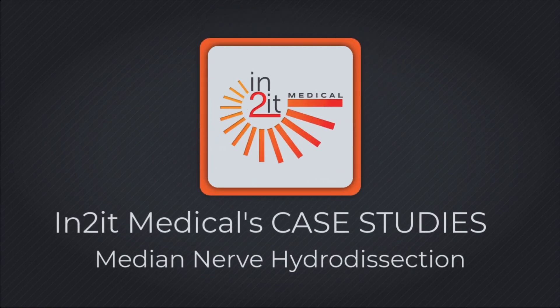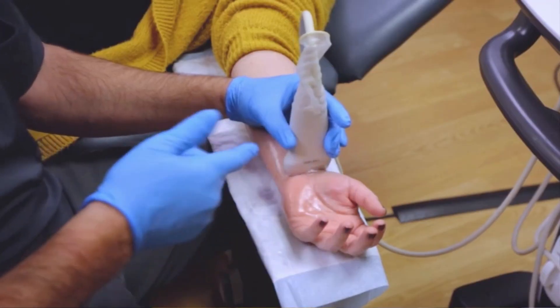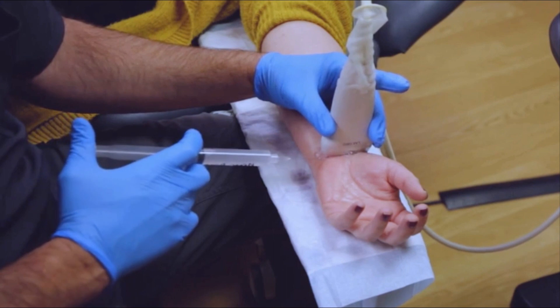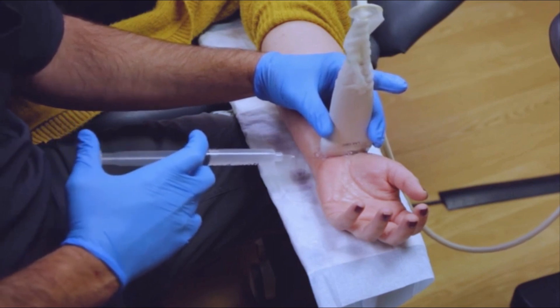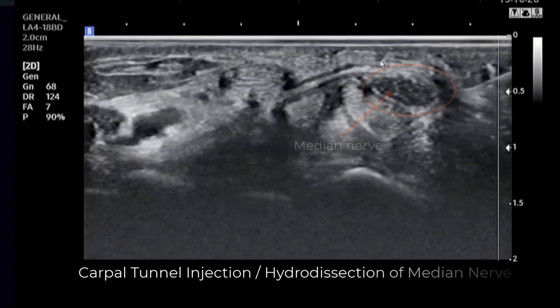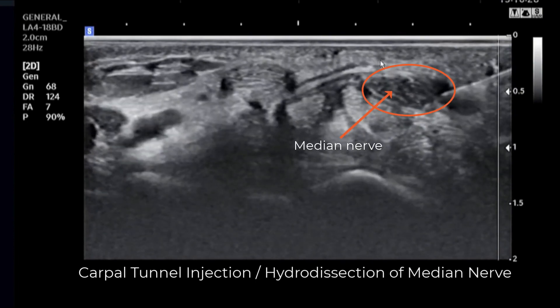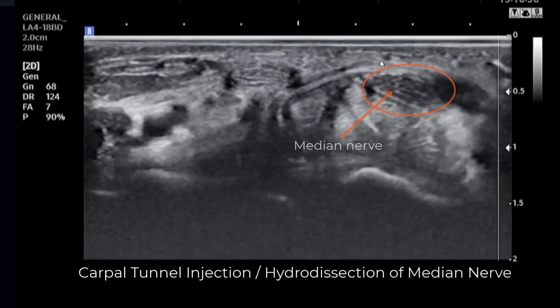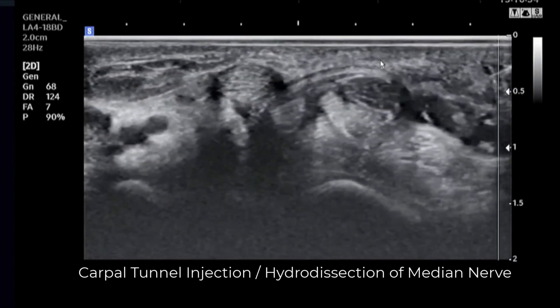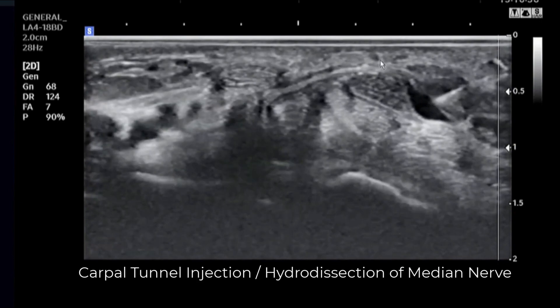Welcome to Intuit Medical's case studies. Today we are discussing the advantages of using ultrasound to perform a median nerve hydrodissection. A hydrodissection is when water, or in our case D5W or dextrose in water, is used to dissect a nerve from surrounding connective tissues. This is advantageous when coupled with ultrasound guidance to precisely free a nerve from tissue that may be causing the nerve to become inflamed.